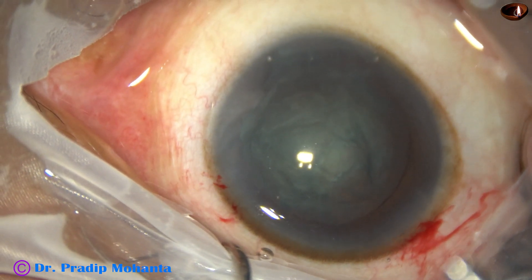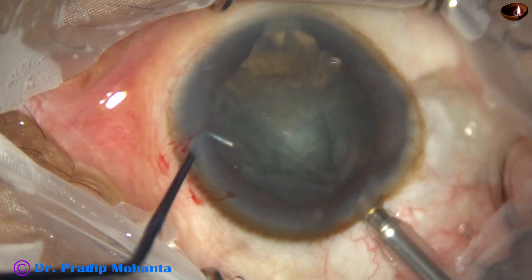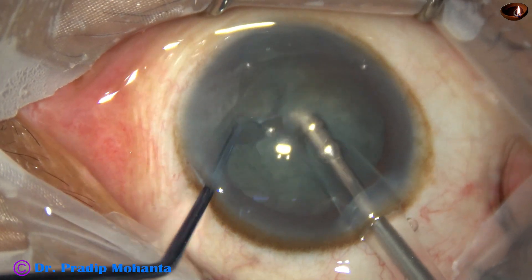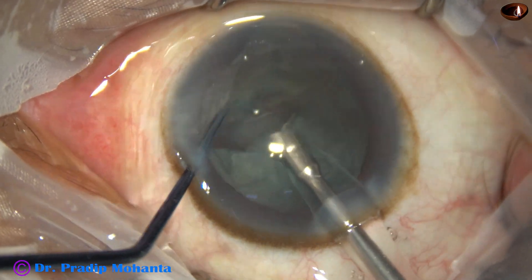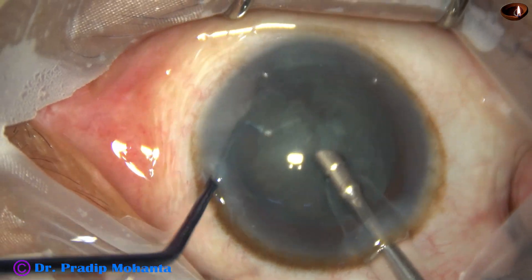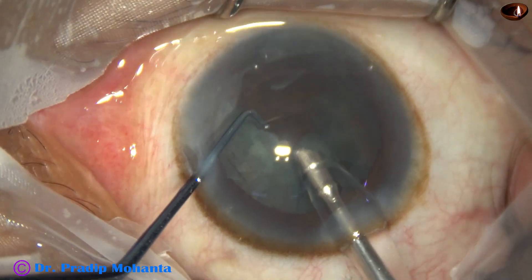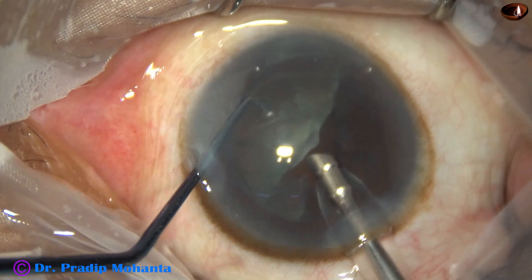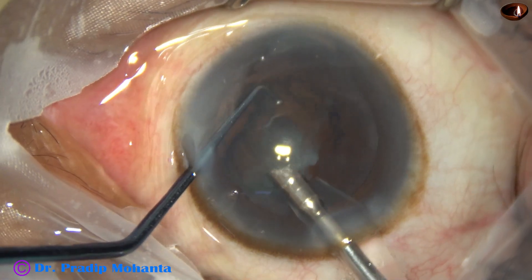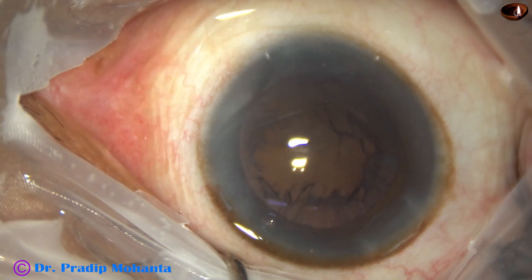Now it is time to go into the anterior chamber with the phaco needle. The phaco needle goes in with its bevel down; some superficial cortical lens matter is removed and I try to hold one piece. The nucleus is very soft — the two pieces are coming but it is difficult to bring them out. Engage the hemi-nucleus and chop it with the nucleus sustainer; if it cannot be chopped, just start emulsifying from outside and finish it off.